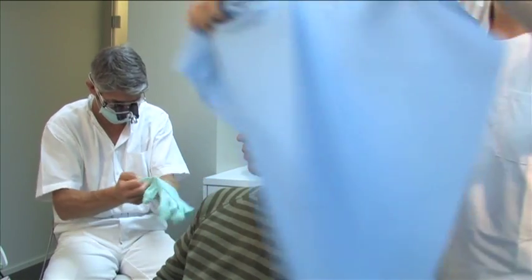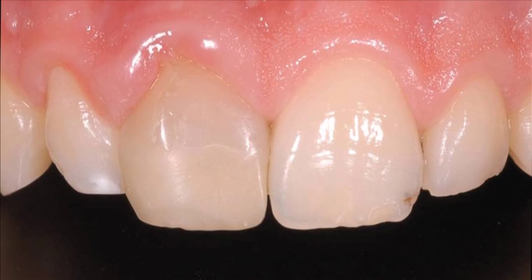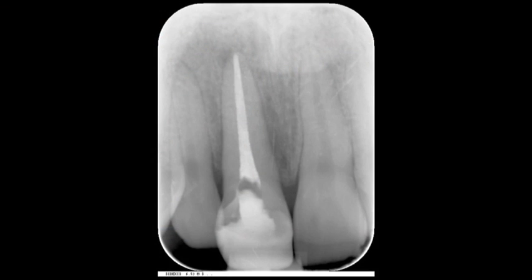During the clinical examination of a 19-year-old patient, a horizontal fracture line was detected on the labial aspect of the upper right central tooth, which ran approximately 4 mm coronally to the gingival margin. The mesiodistal width was 1 mm less than tooth 21. The gingival zenith for teeth 11 and 21 were at the same level. A sufficient root canal filling on tooth 11 was visible on the radiograph.